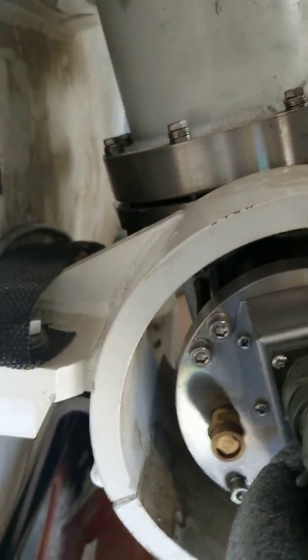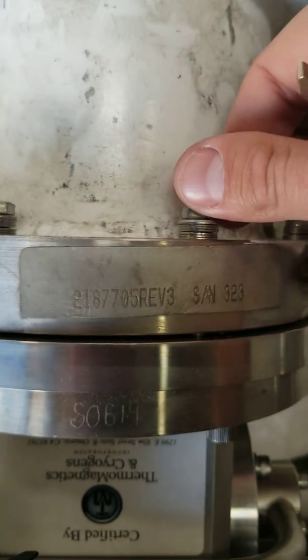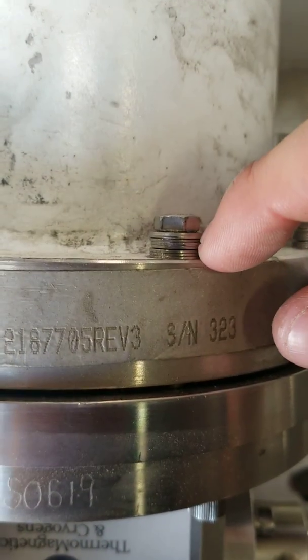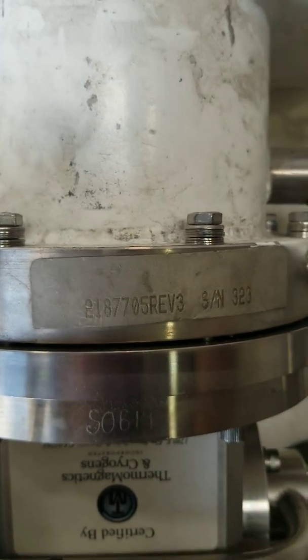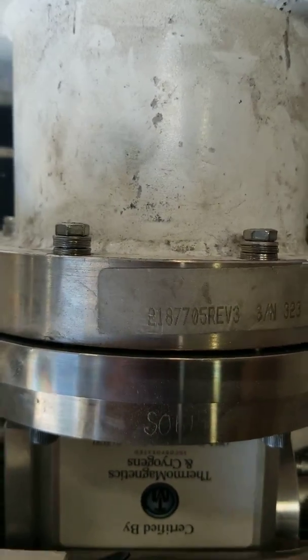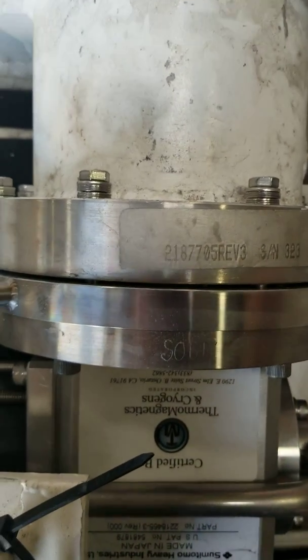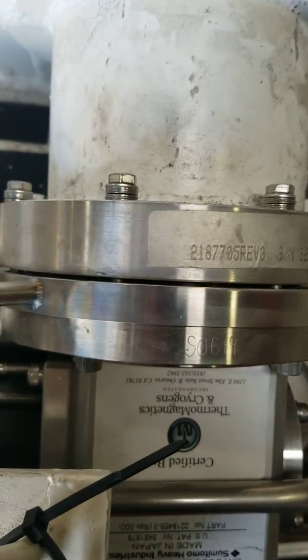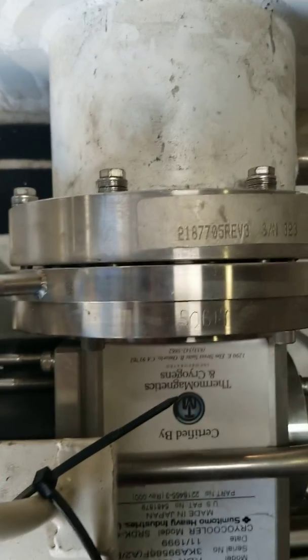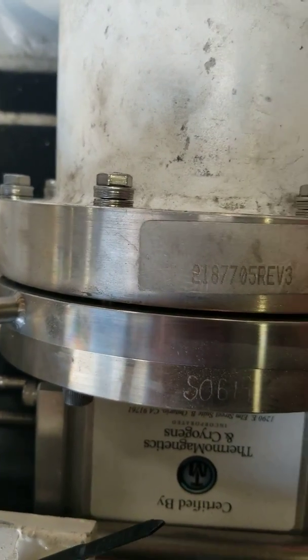And then when you have the cold head bolts, they're going in two different directions so that it makes a little space. If you can see that tiny little space in there, that space is there so that you can tighten the cold head bolts near the end of a cold head's life, and it buys you a week or two, brings the pressure down, brings the temps down, and it improves the cold head temps for a little bit when a cold head is dying. So I'm going to show you how to tighten those bolts near the end of the life.